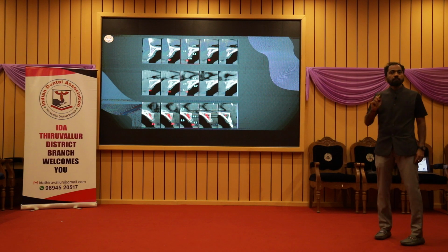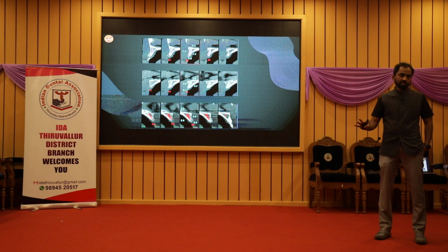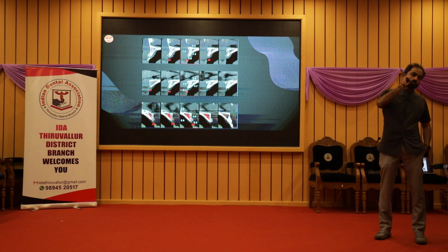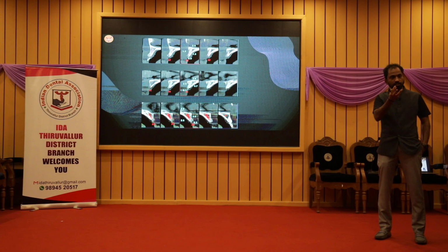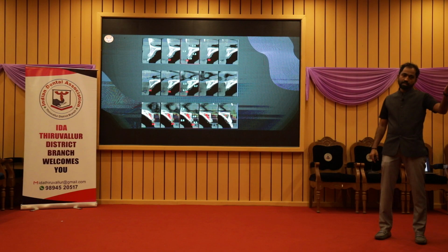But, and this is mandatory, this is a tip. What I'm going to tell you is, I think everybody, the senior practitioners, will be doing maxillary with Densah. You have to do osteodensification. Even if bone is there or not there, it doesn't matter. You have to do it, because whatever you are taking off with the drill is the original native bone. If you have to buy that, you will have to give another 5,000 to buy it. So when you drill it, automatically bone will go off.